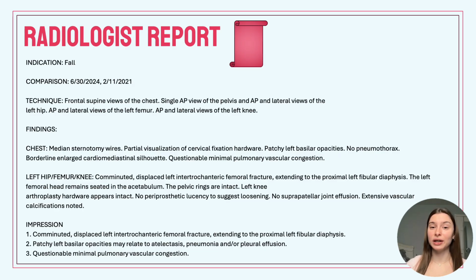So next we have the radiologist report, and under findings for chest, it says median sternotomy wires, partial visualization of cervical fixation hardware, patchy left basilar opacities, no pneumothorax, borderline enlarged cardiomediastinal silhouette, questionable minimal pulmonary vascular congestion.